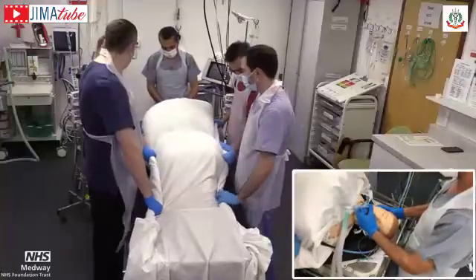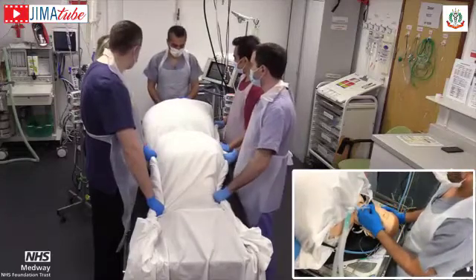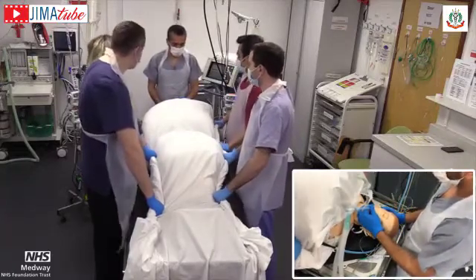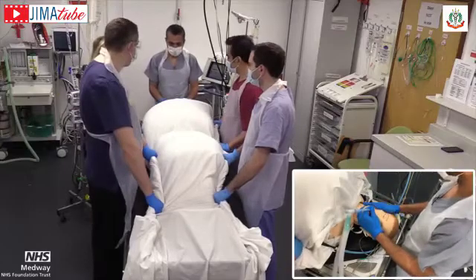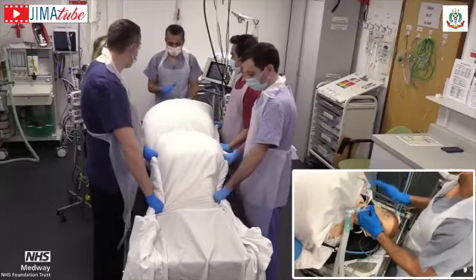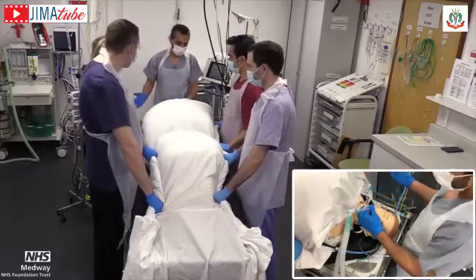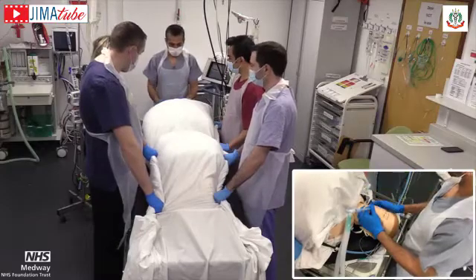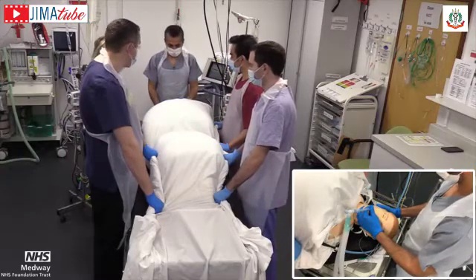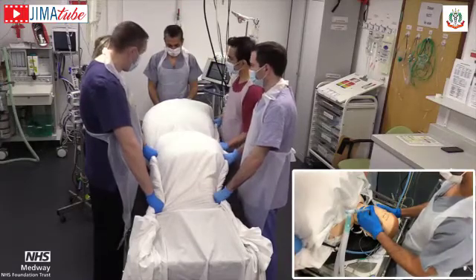So Vipul? Yeah, so I'll take care of the central line and endotracheal tube, and on my call we will start rolling. The plan is, if the central line is on the right side, to keep the central line always on the up side. So we'll roll the patient towards the patient's right side, and then we will slide the patient on the right side, and then we'll roll the patient, so that the line is always on top and it's not getting entangled with the neck or the head, which then becomes problematic. Okay.